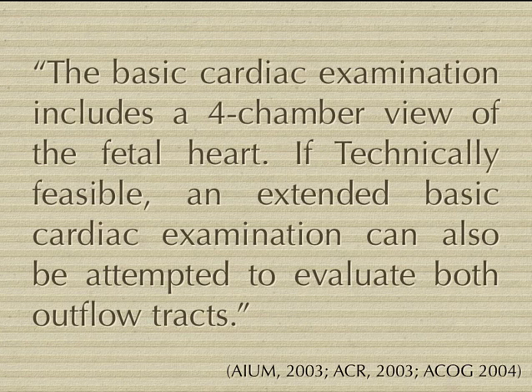The basic cardiac examination includes a four-chamber view of the fetal heart. If technically feasible, an extended basic cardiac examination can also be attempted to evaluate both outflow tracts. If evaluation of the outflow tracts is not technically feasible, then the physician should document why the evaluation cannot be performed, and consideration should be given to reevaluating the heart at a later date, or the patient should be offered the option of being referred to a specialist to examine the fetal heart.